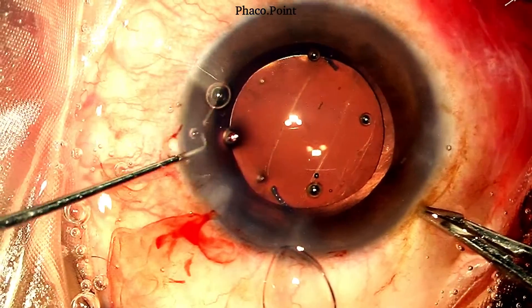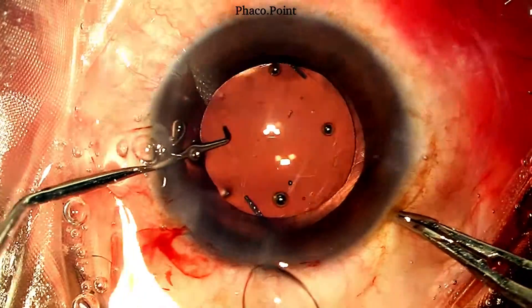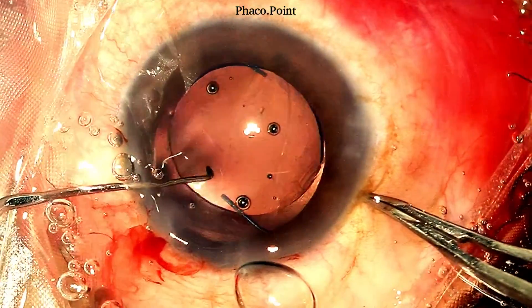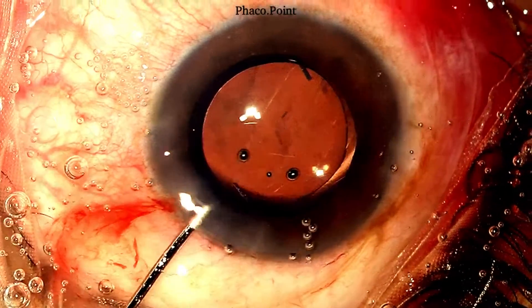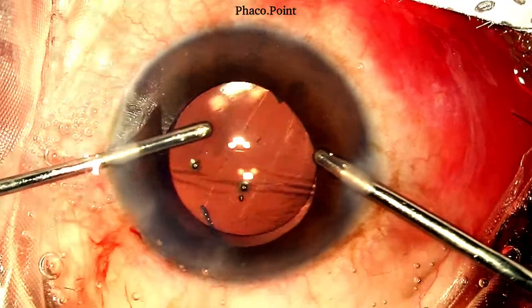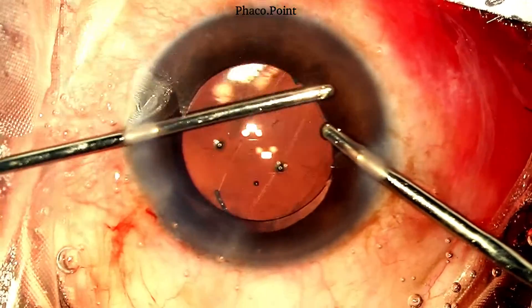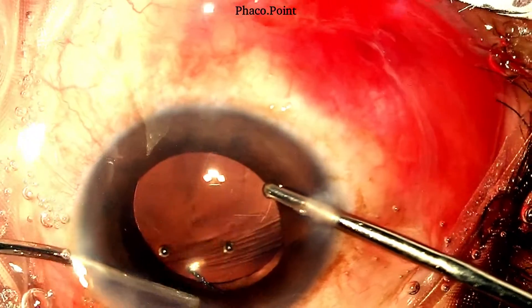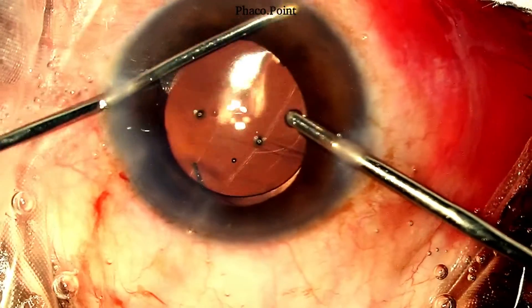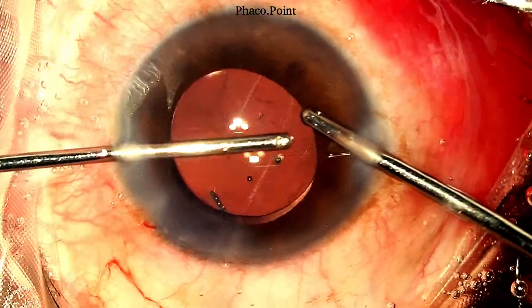Once the IOL is stabilized in the ciliary sulcus, we proceed to performing a posterior optic capture, wherein the edges of the optic are slid under the anterior capsular edge. We now come to the penultimate step: removal of the excess viscoelastic from the anterior chamber. No excessive movements of the IOL are performed here, as we have a well-stabilized IOL with the haptics in the ciliary sulcus and the optic under the anterior capsular edge.